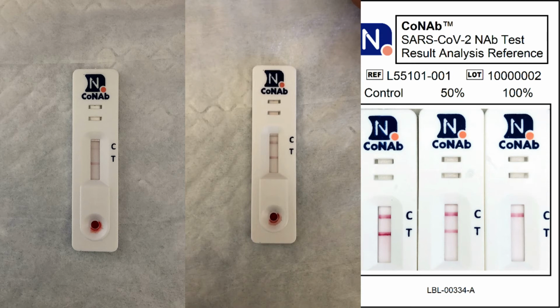Users may see 1 or 2 lines. A control line or letter C indicates the test is performing adequately. A line at the letter T or test line is the specimen result. The more faded or faint this line appears, the more neutralizing antibodies to COVID-19 are present in the specimen.